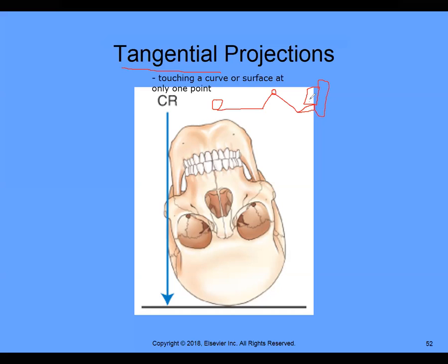And again, if I'm only touching a curve or surface with the central ray, that means that I'm shooting the X-ray to point to that particular kneecap.